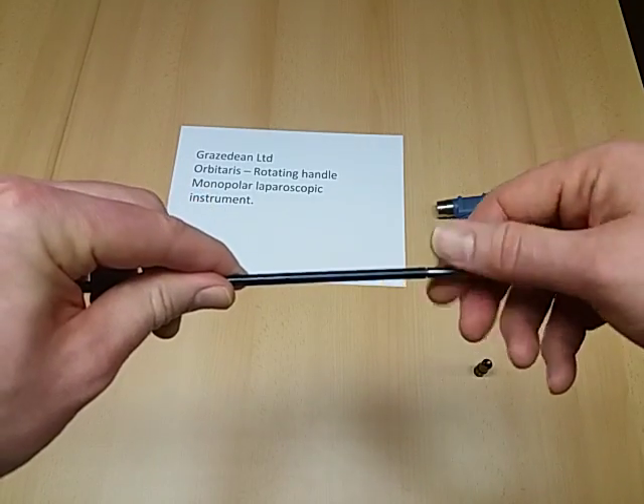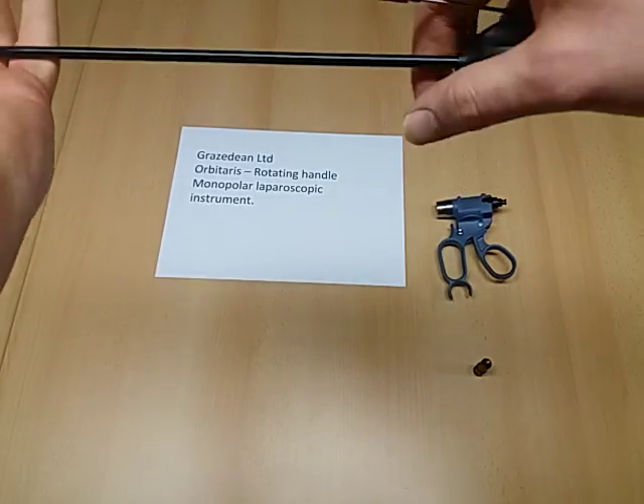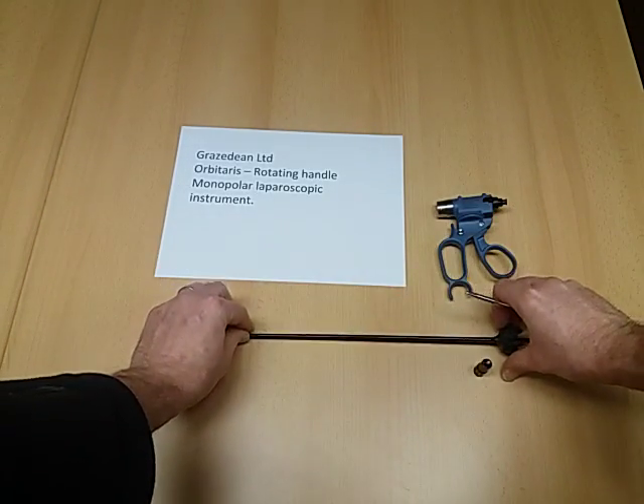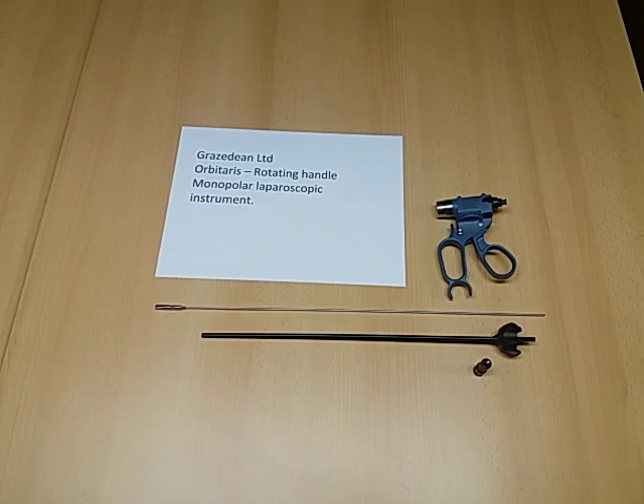The electrodes simply unscrew from the shaft, again giving good cleaning properties and quick and easy exchange of electrodes. All components are available separately, allowing for cheap and easy repairs if required, or exchanges for different electrode types during operations.